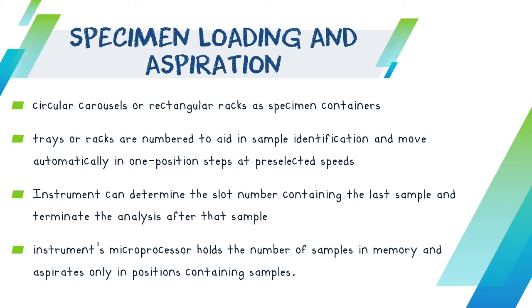So, if in case na, just like for example, kunwari na amoy rack holder that can hold up to 5 samples, and then you only place 2, and then empty na ang 3 slots, your auto analyzers could actually also identify na duha lang yun dito sa inyuhang rack ang naa lang jud sample. So again, it's a matter of encoding and scanning. Other than encoding, scanning of your machines sa kung unsa ang naagyo dito sa inyuhang rack.